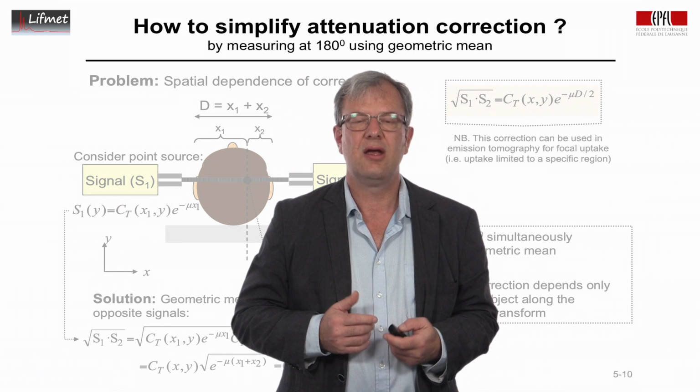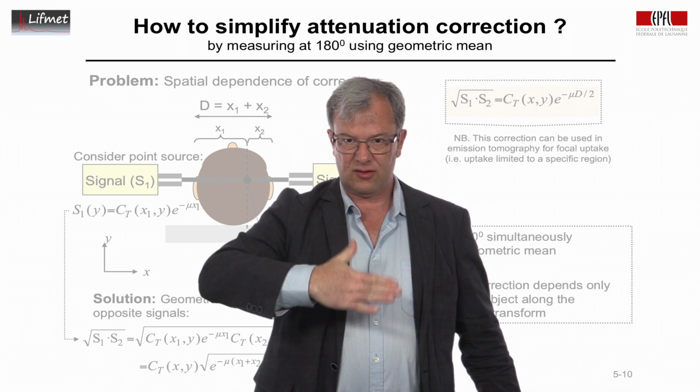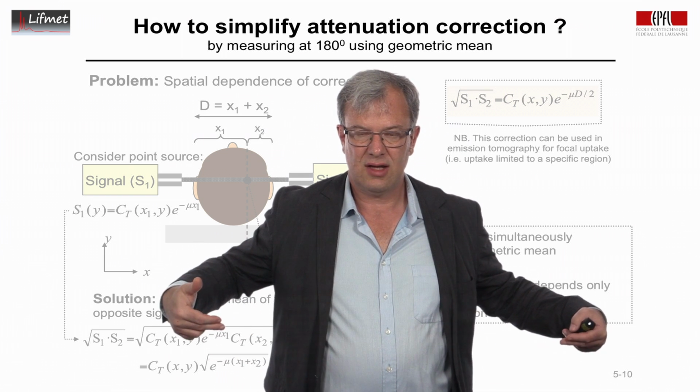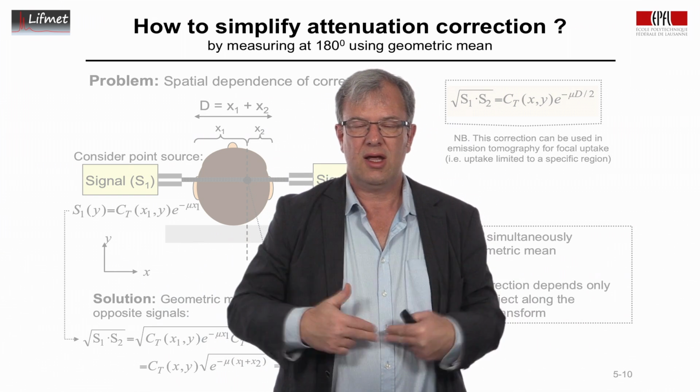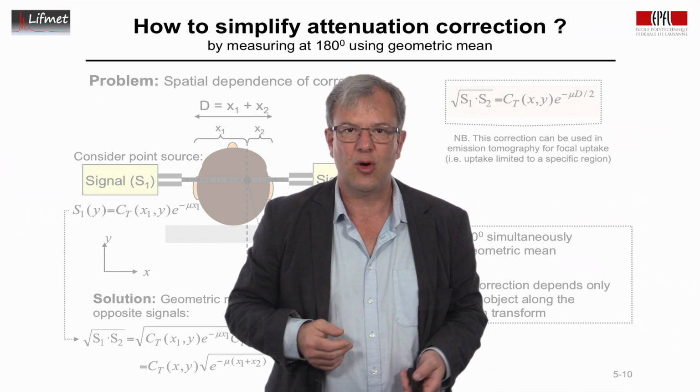So this is a simplification, but clearly if we do a scan in this direction, with the scanner here, or if we have the scanner here, the distance that the X-rays in total pass through is different for this dimension and this dimension, at least for most of us.